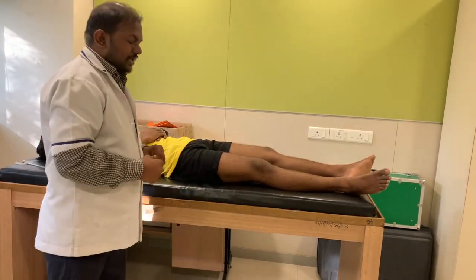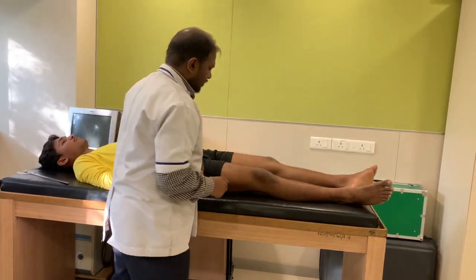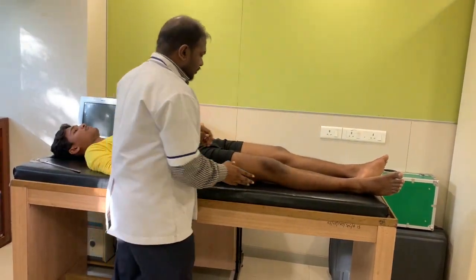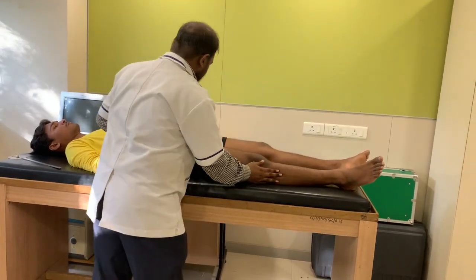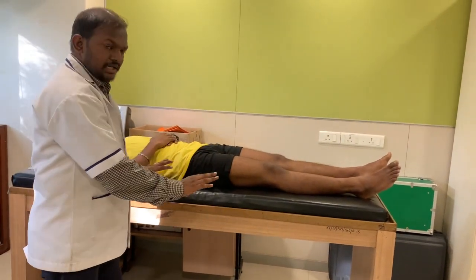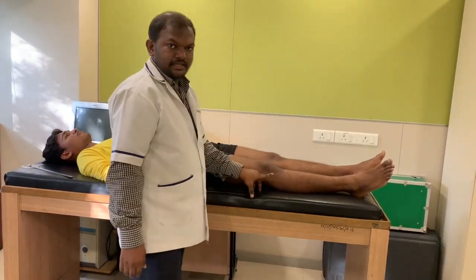To check the knee flexion range of motion, firstly we have to take the subject in a supine lying position, and you have to make sure that the knee and the hip are in 0 degrees of extension and 0 degrees of rotation. So it should be in a straight line, and initially the knee should be extended.